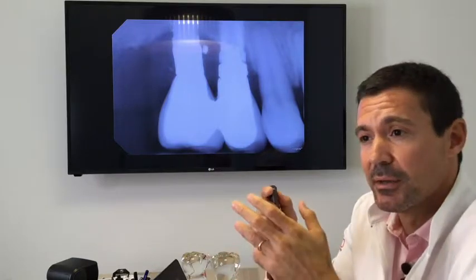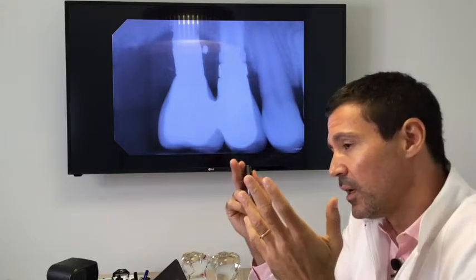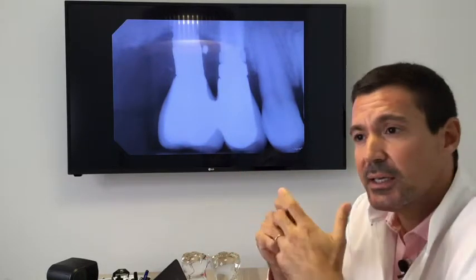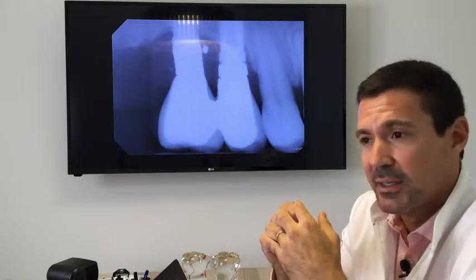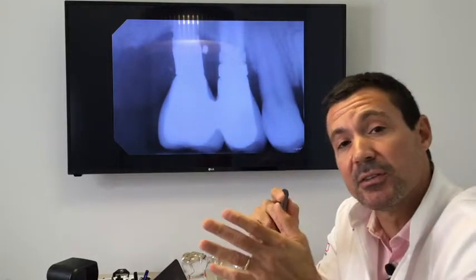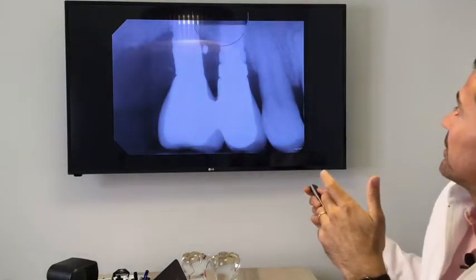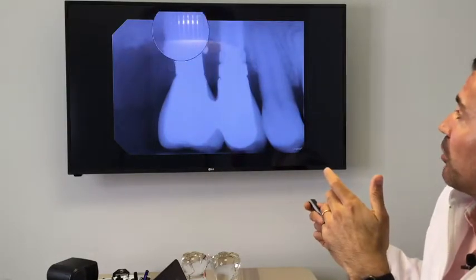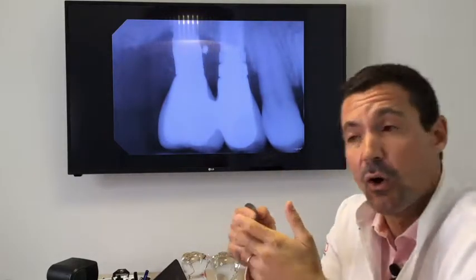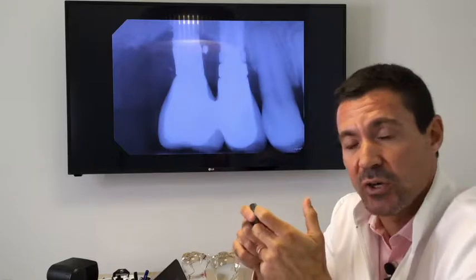So I tell the patient, listen, we can do a lot of things. It's a patient that in 2 weeks is going to go away for 2 months. He's going to disappear. And he needs some stability of the structure. And I tell the patient, we can go look for the screw and try to re-screw through the crown that is cemented. There's a risk of breaking that porcelain, but we need to access. Otherwise, this problem will develop a new problem, because this screw is holding the structure, and this screw might experience either a screw loosening as well or a fracture. So at this point, you need to go and try to stabilize the situation.